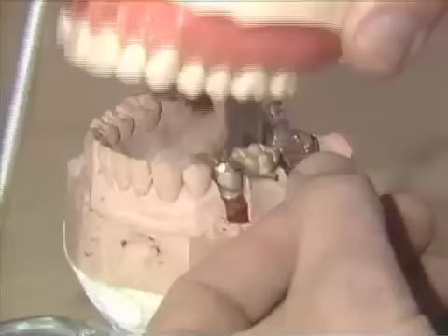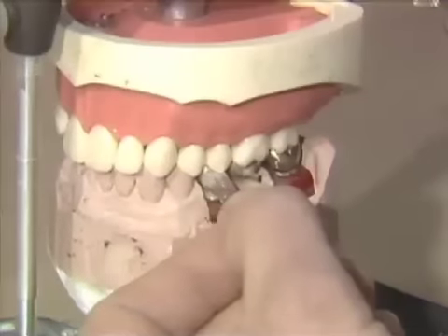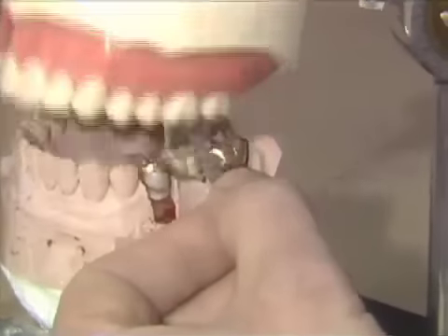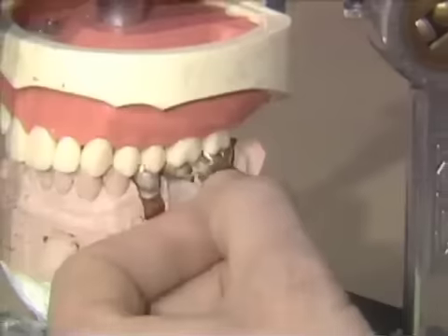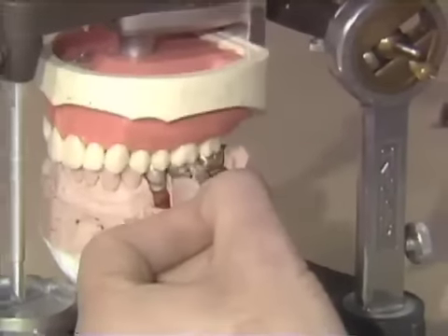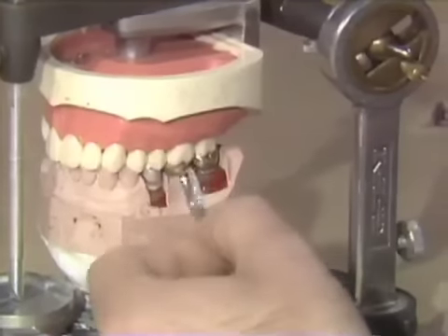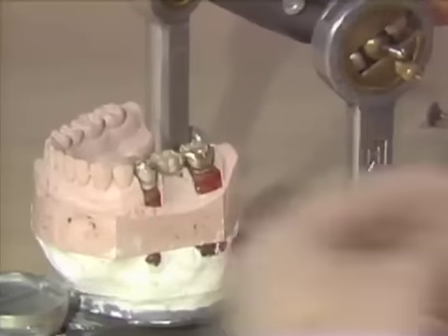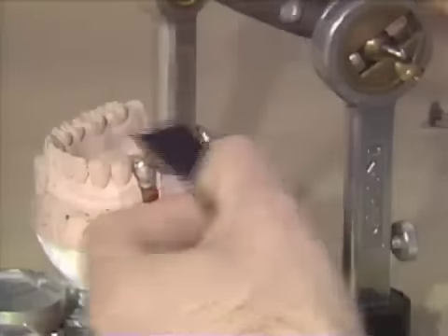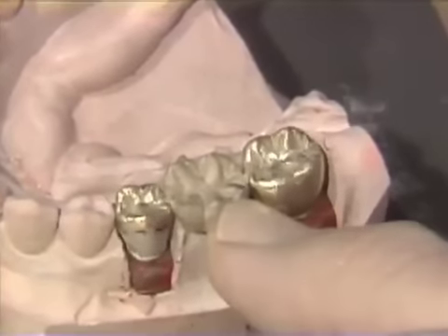Now if I close the articulator down, you notice that we're light on the molar, light on the bicuspid, and here's a heavy spot on the pontic — we're a little heavy there. Coming out towards the mesial on the pontic, we have no problems. So we've just got one little spot here that's holding us up on the pontic. We don't have very much adjustment to do at all. We're up on the triangular ridge, that distal buccal cusp, and we'll just adjust that.